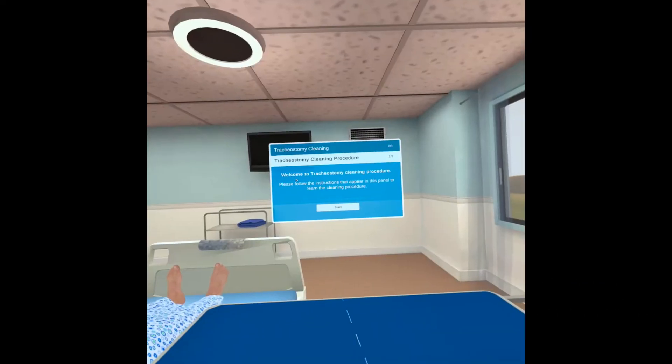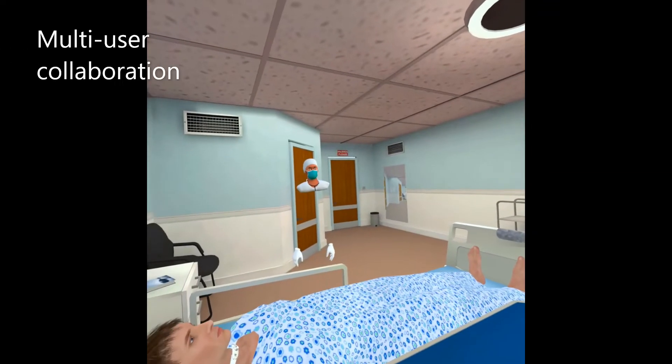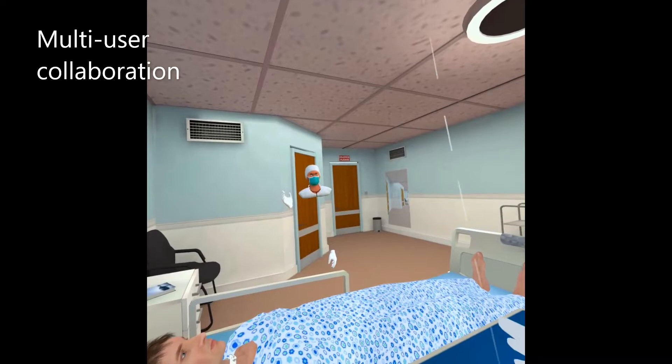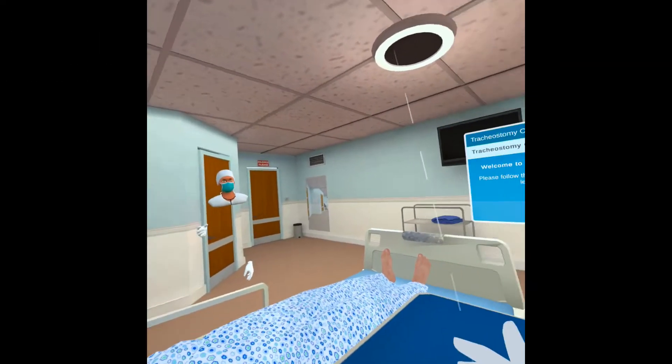Please follow the instructions that appear in this panel to learn the cleaning procedure. An expert has joined to observe and guide. Hello. Hi. Hello.